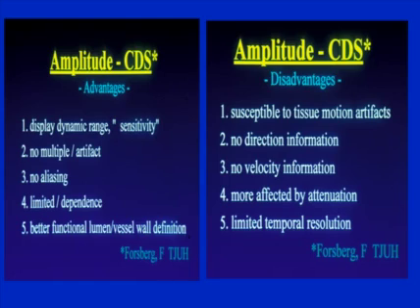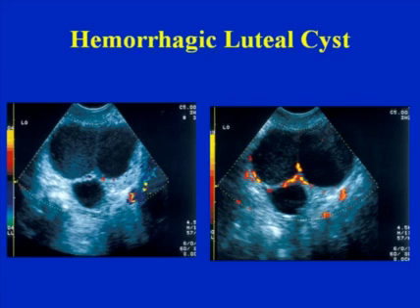And there's limited temporal resolution, and this is going to play into when we talk about tumors and depiction of small capillaries, that the Doppler technique is in fact limited relative to contrast where you're looking at small capillary flow.